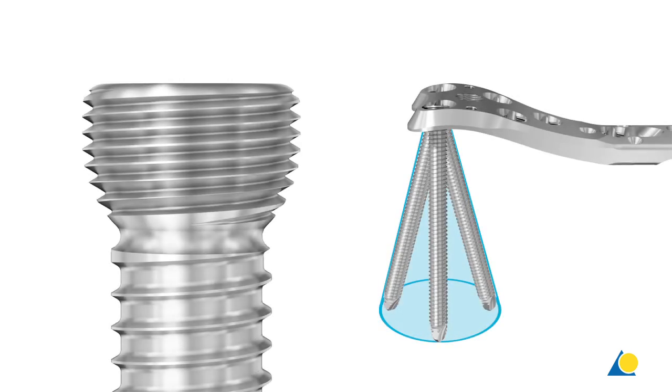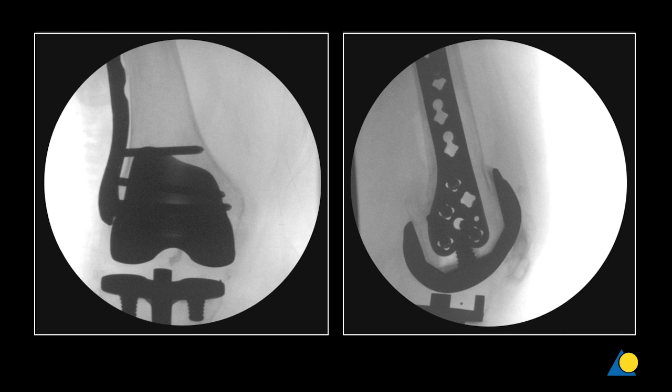The head of the 5.0 mm variable angle locking screw is rounded to facilitate various angles within all variable angle locking holes. Screws can be angled anywhere within a 30-degree cone around the central axis of the plate hole. The variable angle is of value in articular fractures and in periprosthetic situations.